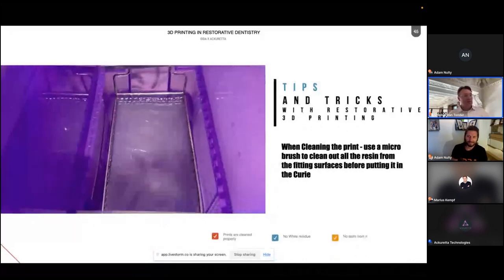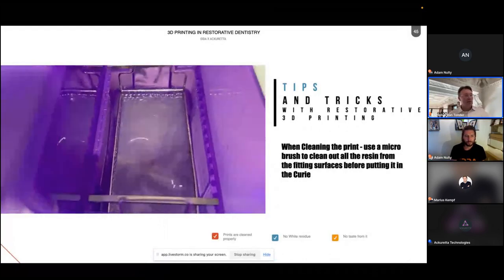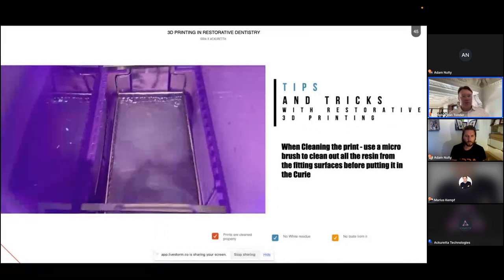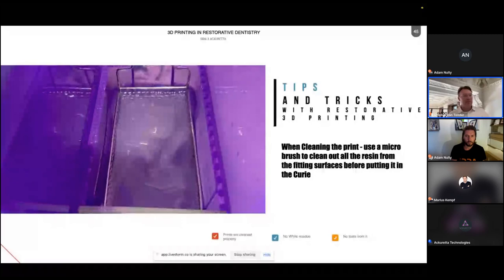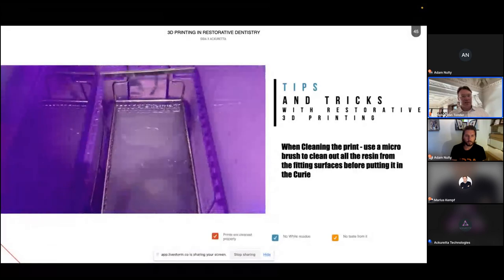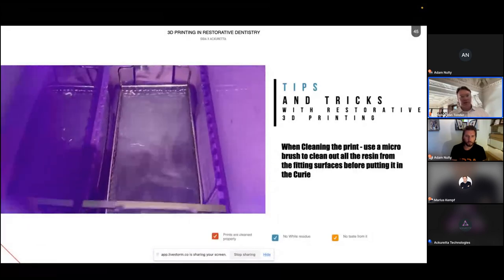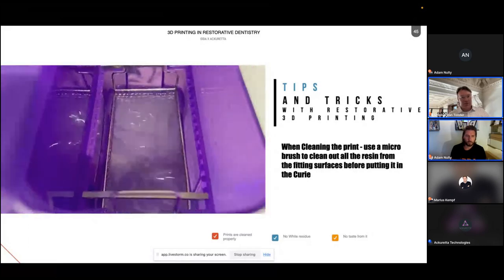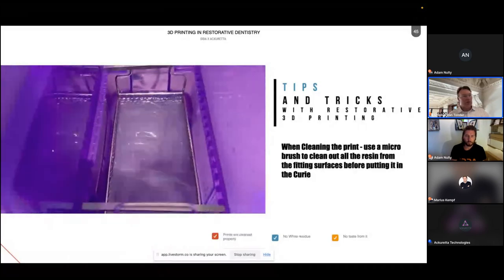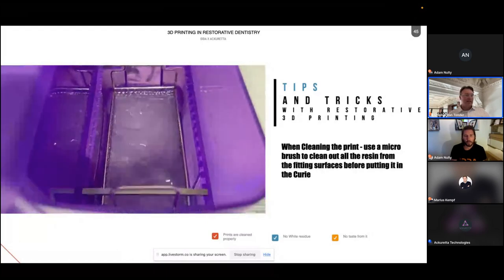And then, yeah, if we get to cleaning the print, this is the Innova wash in there. What I normally do with this is I'll take it out and I'll use a little micro brush to clean the inside of the fitting surface really well. It's really important that you get all of the resin out there before you put it in the curing chamber. If there is only the slightest bit of resin in there, it will not seat properly. So be very, very aware of that when you are printing restorations, that it is really nice and clean. And then the next one.